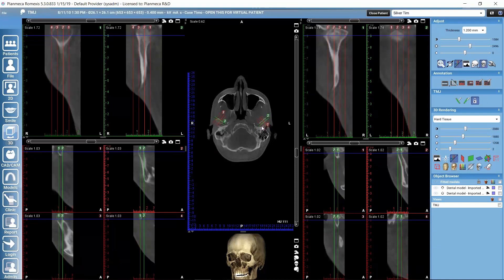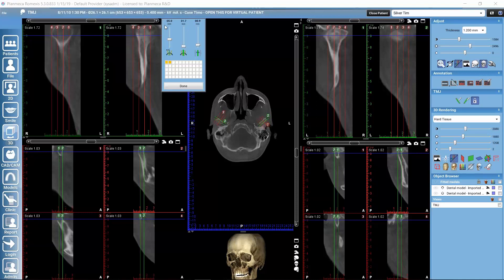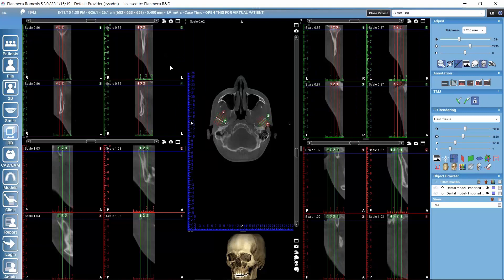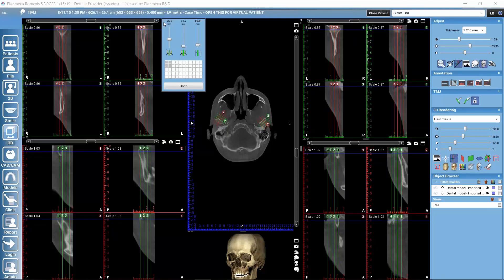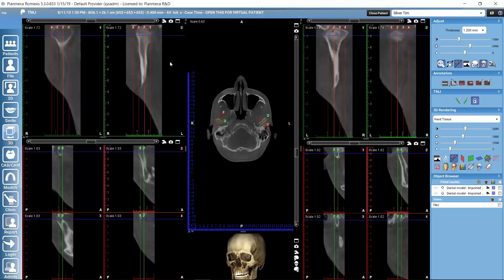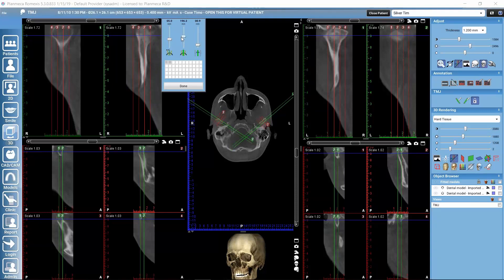The normal controls for adjusting the slice views apply also here. Each of these slice views has these viewport settings icon next to them. From here, we can define how many slices of each view we want to see. That changes automatically also to the other side so we always have symmetrical views on both sides. If we hover our mouse on top of this grid, we can determine how many slices we see. Then we can also determine here what is the width of the slices.